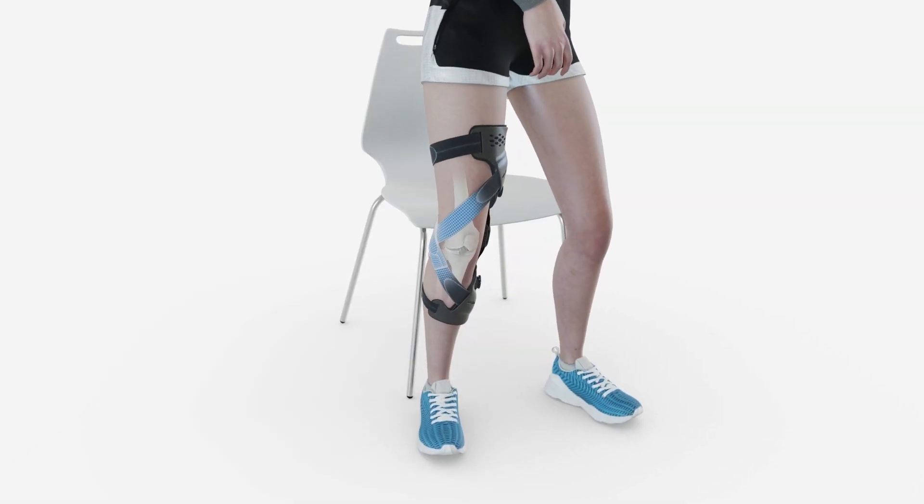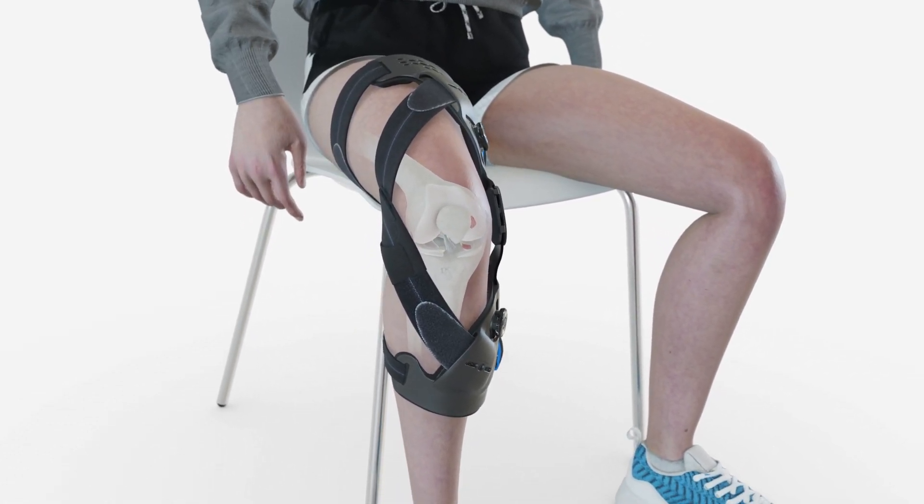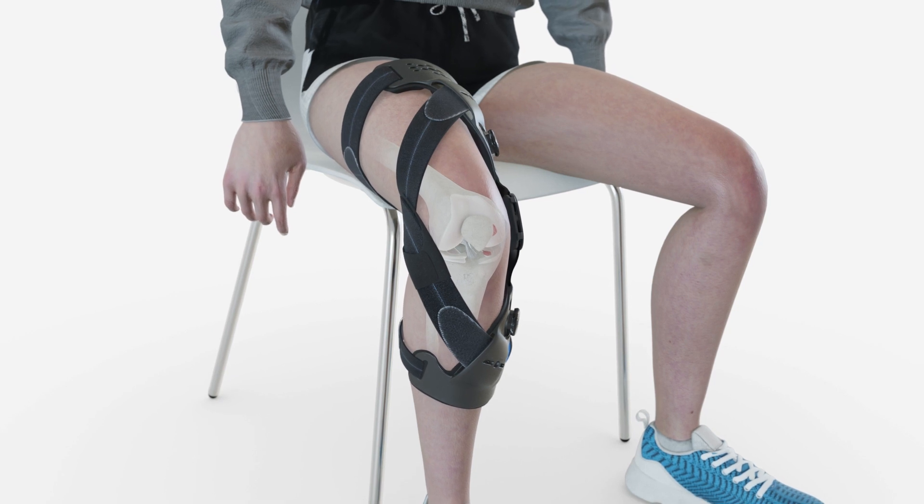As the knee bends, the areas affected by the OA are no longer in contact, so the tension in the dynamic force straps relaxes to improve comfort when seated.